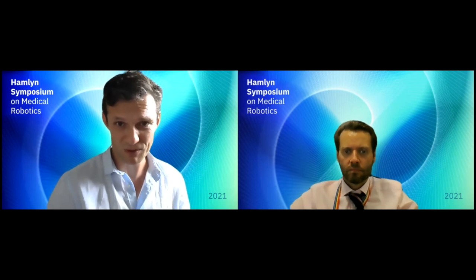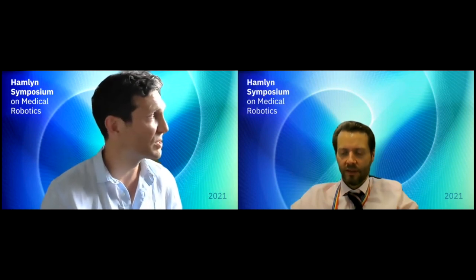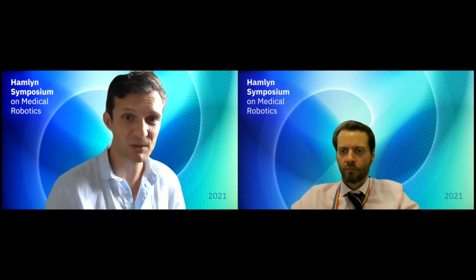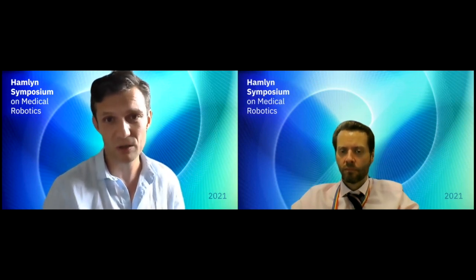There's other challenges as well. So anonymization becomes much more difficult because you're not just looking at internal anatomy, you're looking at the whole scrub team and anyone else that goes into the OR, students and so on. So that's a particular challenge. The dynamics of the video are very difficult. So I think it will be much more difficult to do things like develop navigation systems based on that data. But for things like analytics and potentially event detection and so on, I think it could be quite useful.